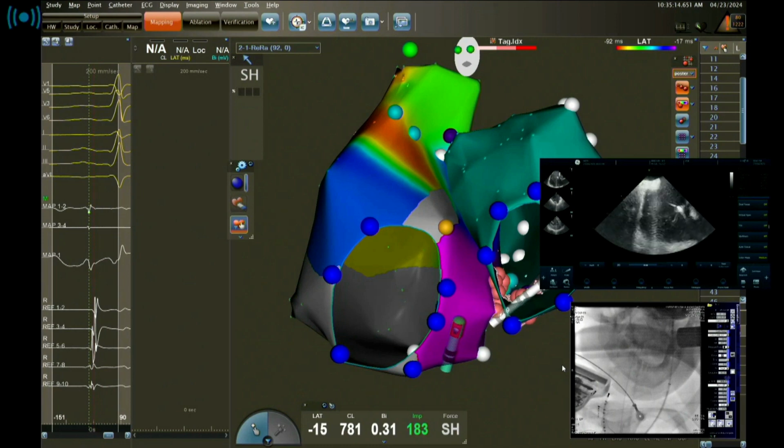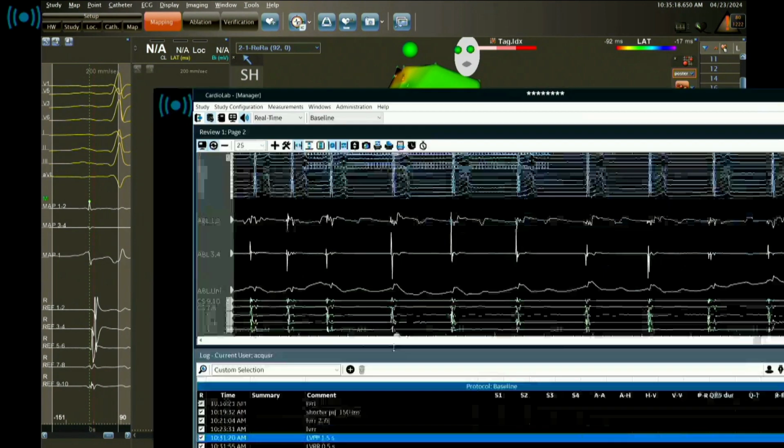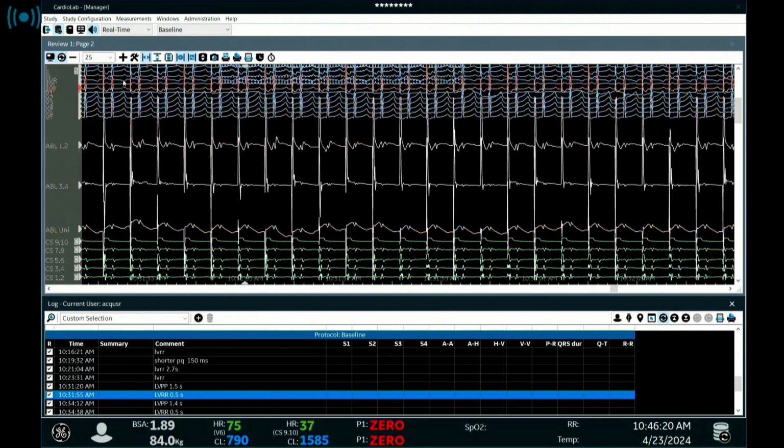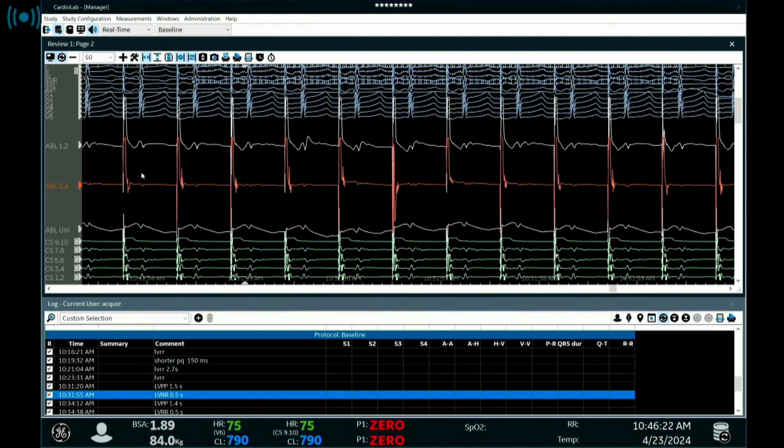So this was the pacing from the left? Yeah. Do you see this? Can you see? Yes. So there is no AV block. This is the sequence of this high frequency stimulation, from here up to here. Before, we got this very long asystole with P waves only during stimulation, and there is nothing left like that. So it's a clear endpoint of the procedure that you abolish this.